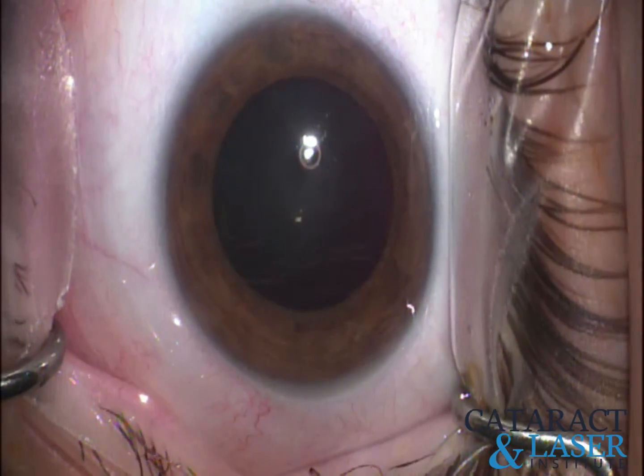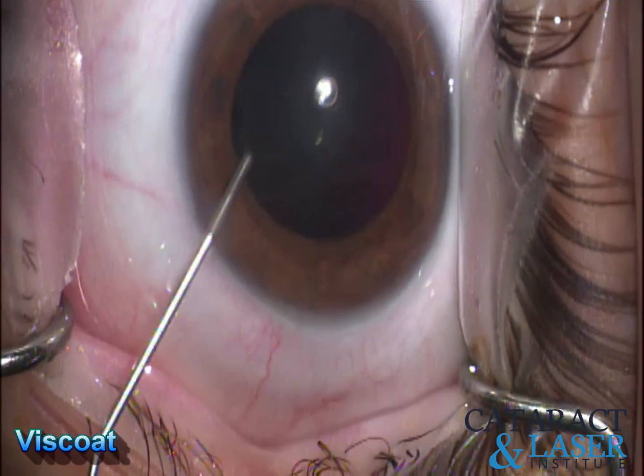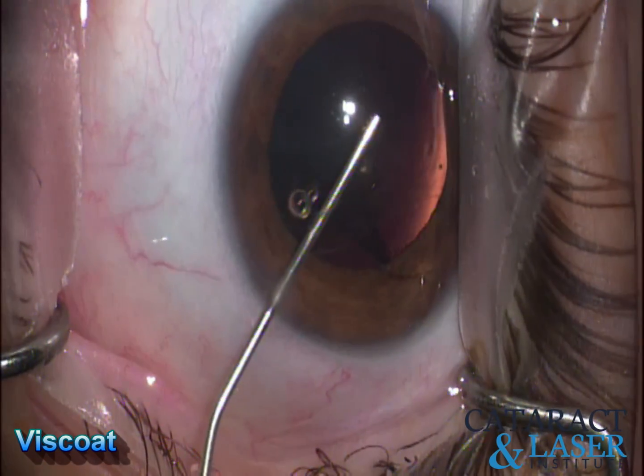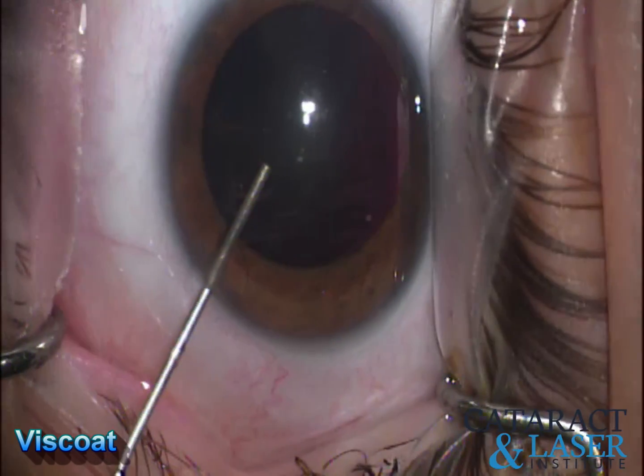Next, I like to inject a dispersive viscoelastic. My preference here is Viscoat. We're going to give ourselves a nice barrier with that viscoelastic — this is going to protect the cornea and give us adequate pressure against the capsule when we make our capsulorhexis.